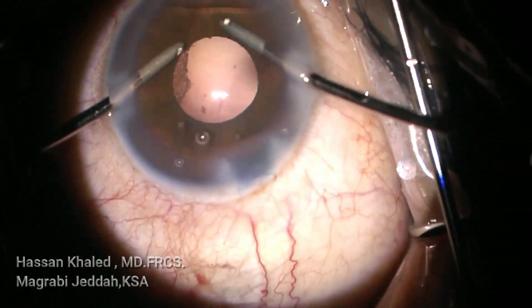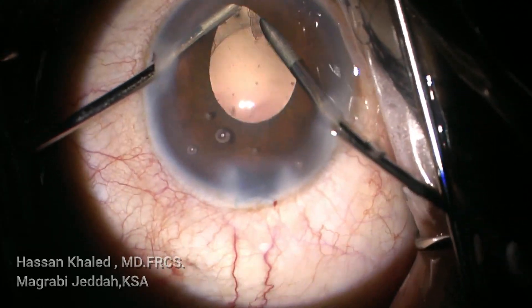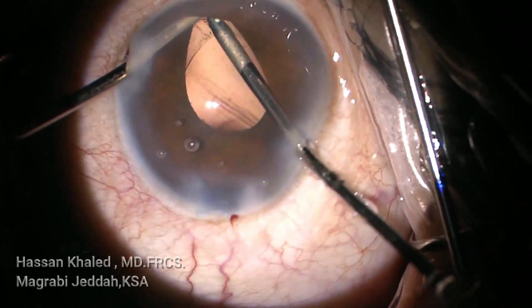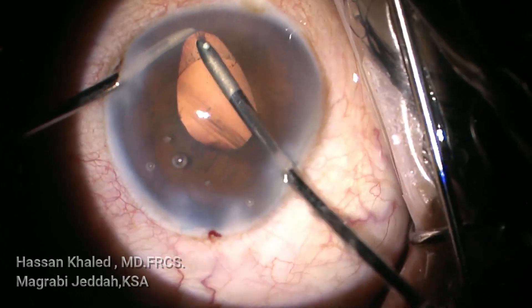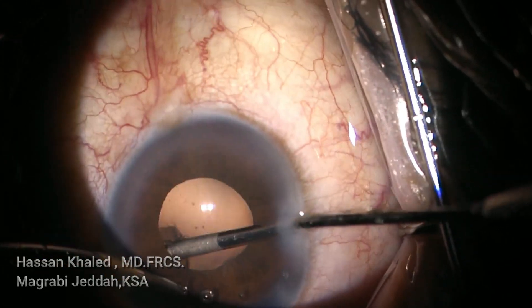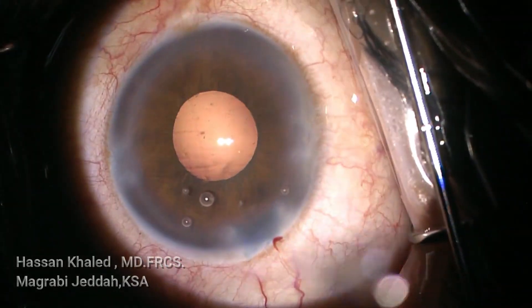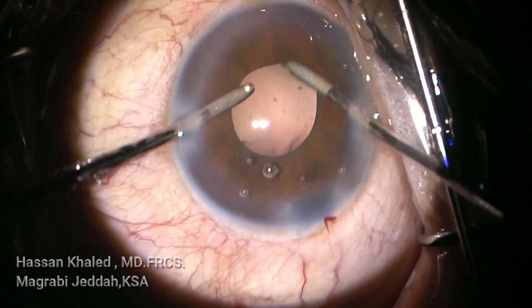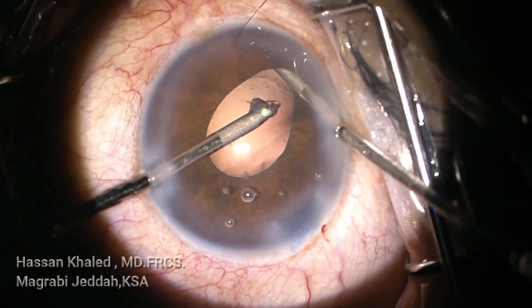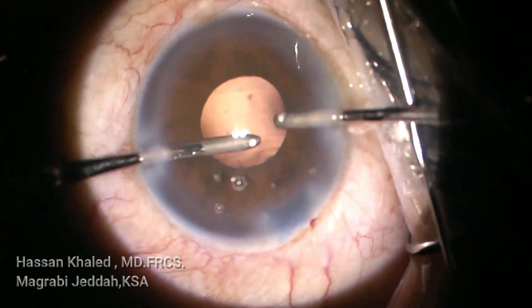You can still see very fine cortex, but the pupil is small. I can use bimanual irrigation and aspiration — using the irrigation probe to push the iris away to see where the cortex is, hold the cortex, peel it, then aspirate at the center. Also pushing the iris with the irrigation probe to see and remove the cortex through this small pupil, which remains a challenge factor in emulsifying the dense cataract.